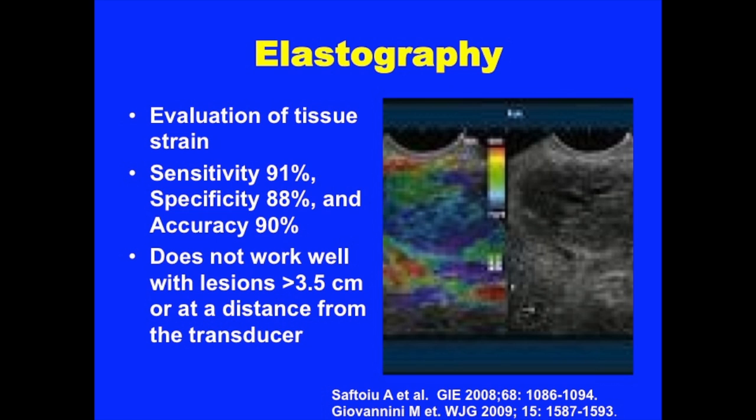So because we're still trying to define where the cancer is in these inflammatory masses, I'm working to try to figure out the big neon arrow that points to where to FNA. And a lot of different techniques have been tried.